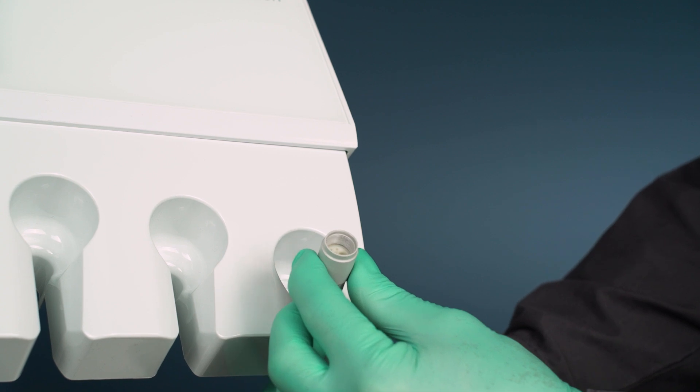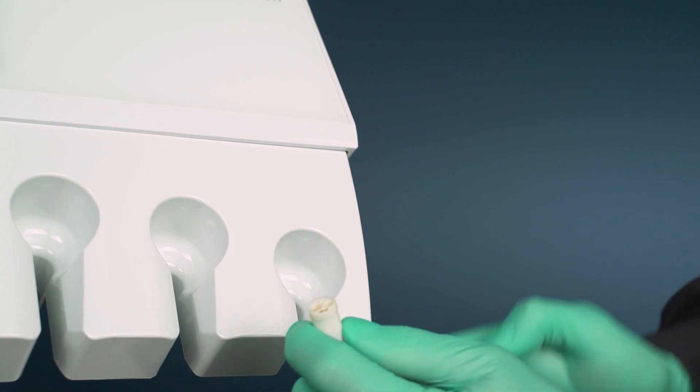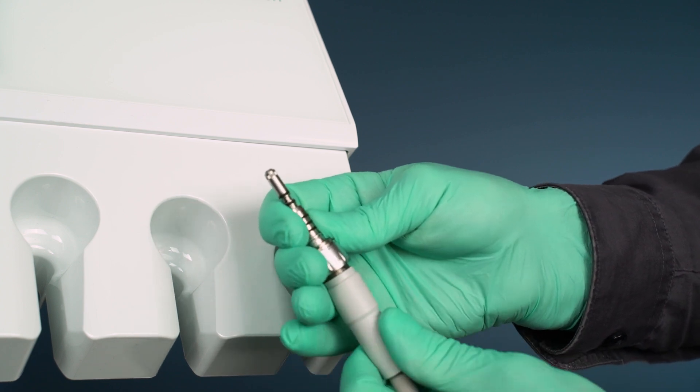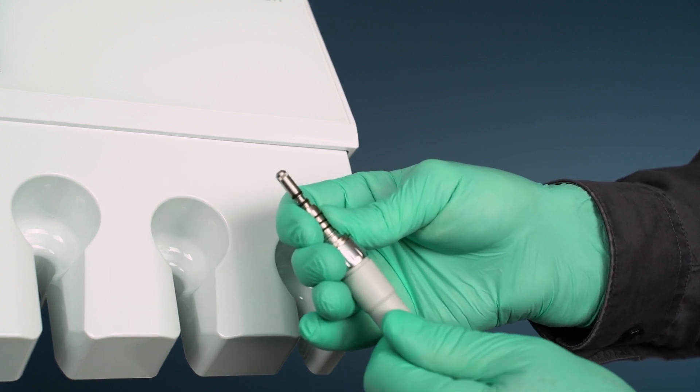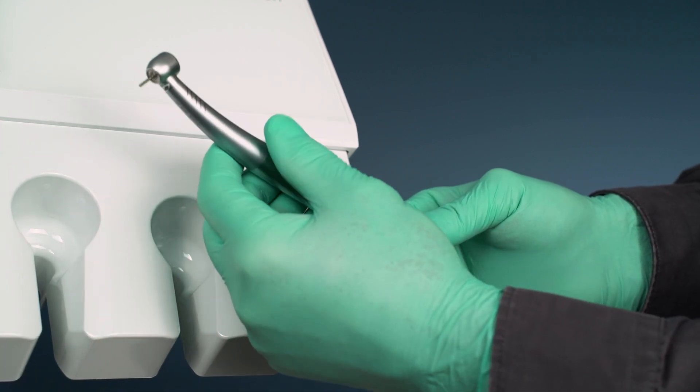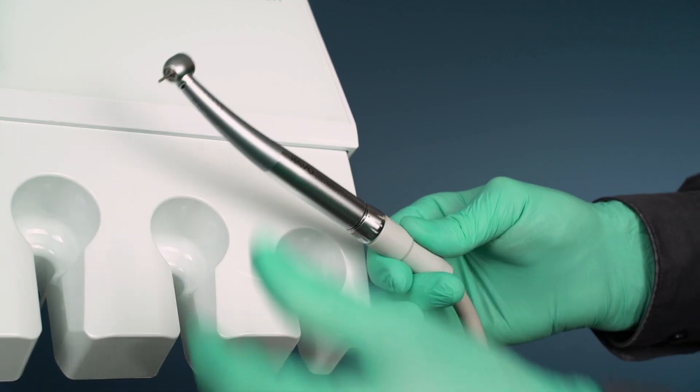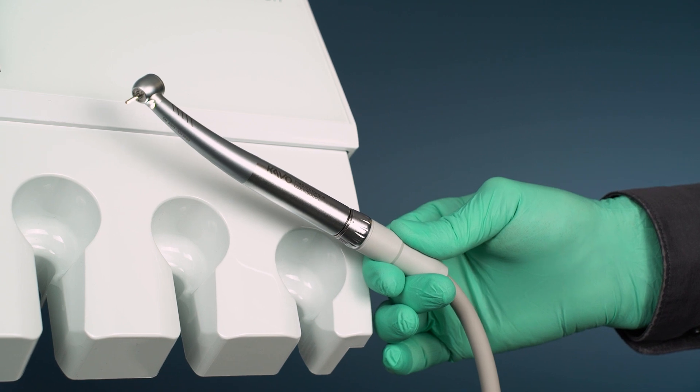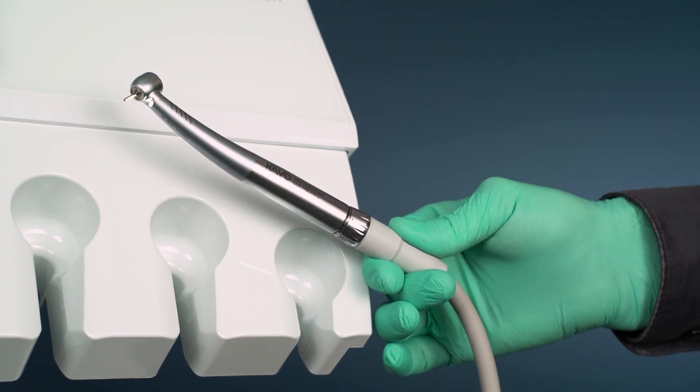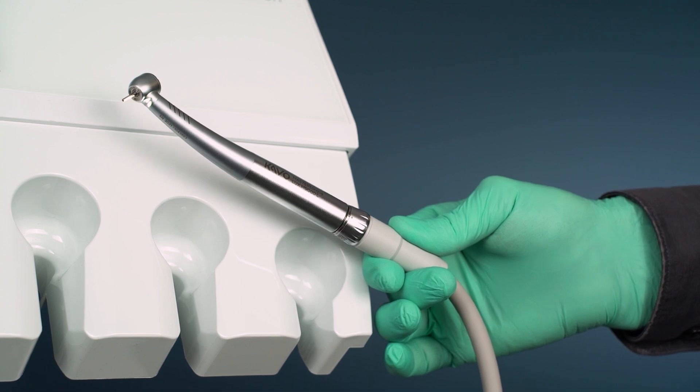The ISO turbine hose with driving air, spray air and spray water is able to run different driving systems as high speeds, intra-flex or air driven motors. The KEIWO Multiflex coupling is perfect for a fast and easy exchange of the different driving systems where the high speed instrument is the most used one.